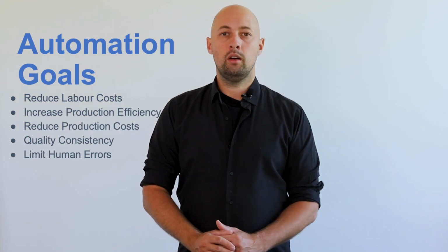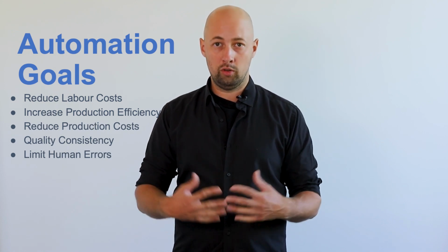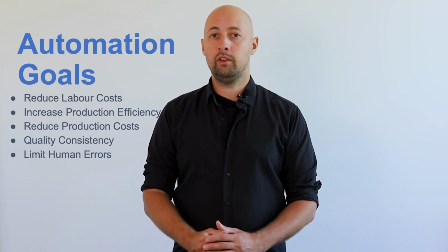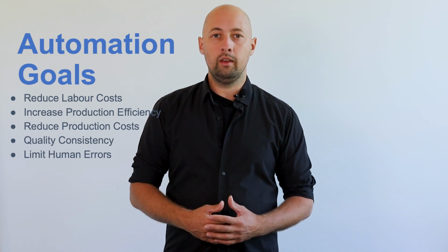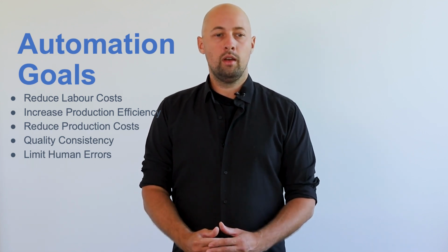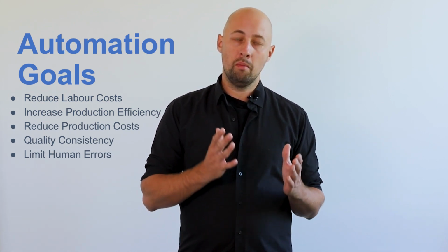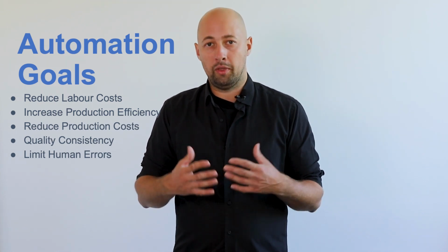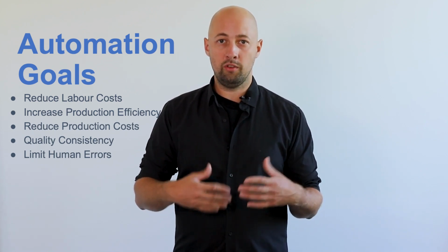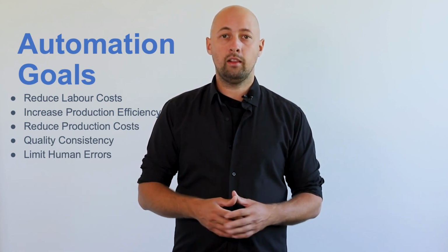So let's talk about the goals of automation, why you actually need that. First of all, you want to reduce your labor costs. This is obvious. Salaries, taxes, medical insurances are expensive, especially if you are operating in the Western hemisphere of the world. But also you want to increase your production efficiency, so you want to produce more aligner units within the same period of time. You want to reduce your production costs, so use your materials more efficiently. And of course you want to have your quality consistent and limit the human errors. So those are the automation goals.